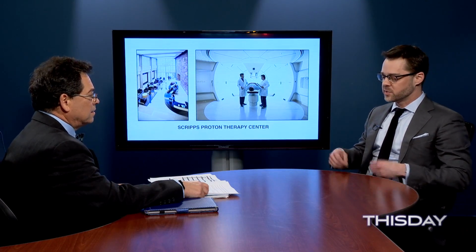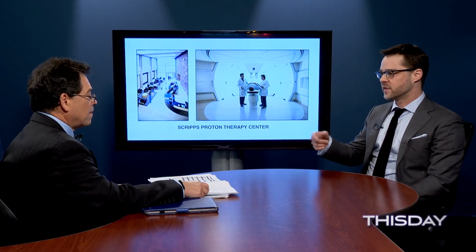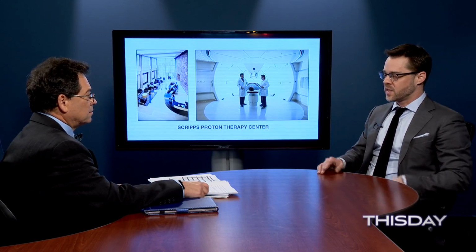When you mean pencil beam, very direct? Okay. Yeah, the pencil beam is basically a small beam analogous to a pencil that's controlled by a magnet. So that magnet will move that pencil up or down or right or left, scanning it through the patient. So we can really direct it to where the tumor is and build a radiation cloud around the tumor, and that cloud can be a very, very complicated shape because we can direct the radiation exactly where it needs to go with lower entrance dose and without the dose coming out the other side.